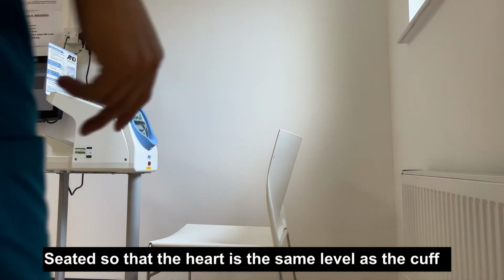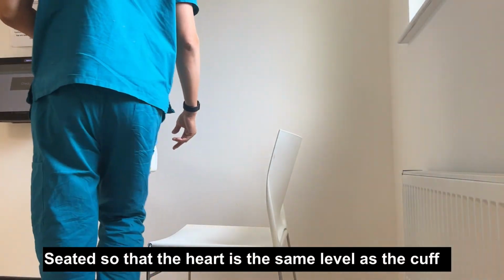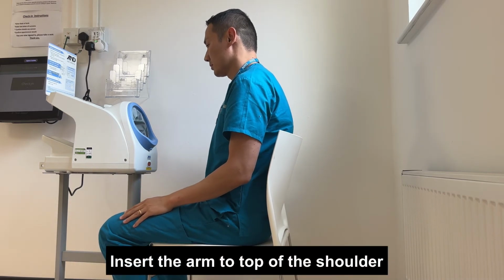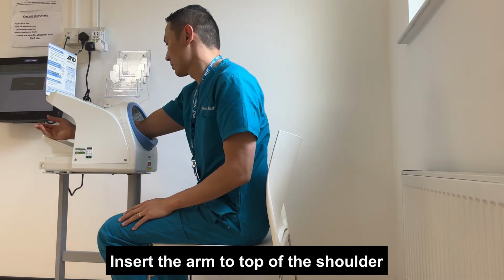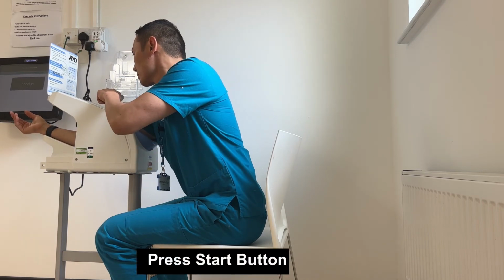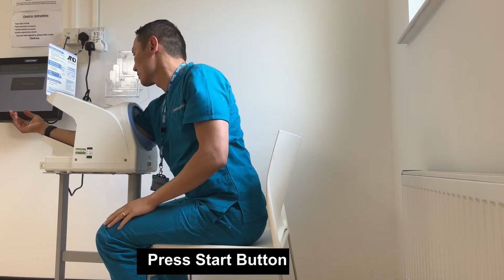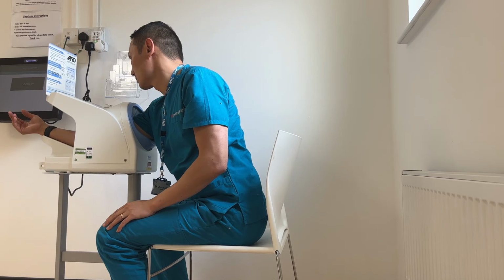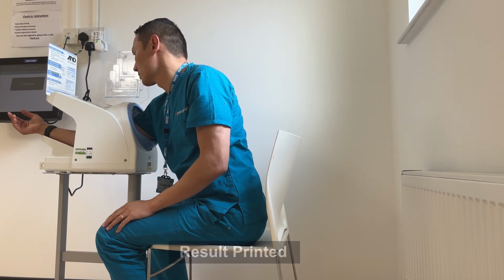To start your reading, you will have a chair next to the machine. You want to insert your bare arm into the arm insertion section up to the top of the shoulder like this. You then press the start button and the cuff will automatically inflate and then deflate automatically after around 1 minute. The result will be displayed and a printout will be printed.